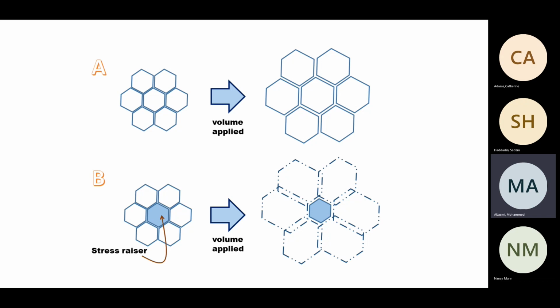So even if you do everything in the right way, the next day someone says, hey, Dr. Megri, by the way, the patient that you started on mechanical ventilation for 1 hour, and you pretended that you know and explained everything about it, ended up with pneumothorax. Is that right? Oh my God. Then what I was doing was not giving equally to one part of the lung. Got it? That's what we call the stress raiser. You don't have to go in depth in it. All right.